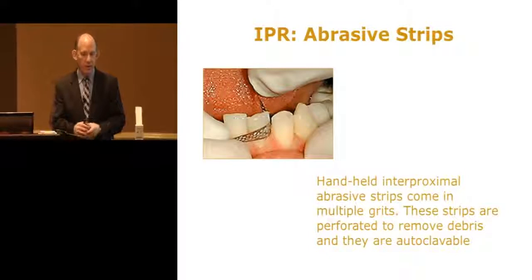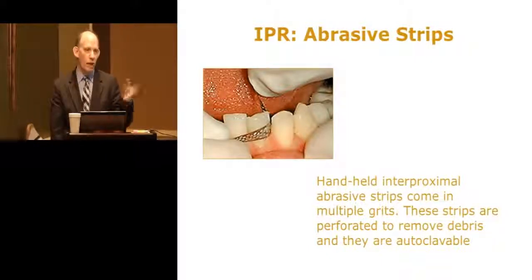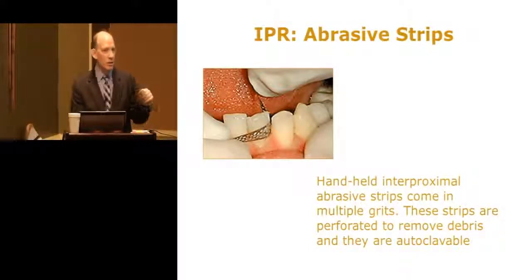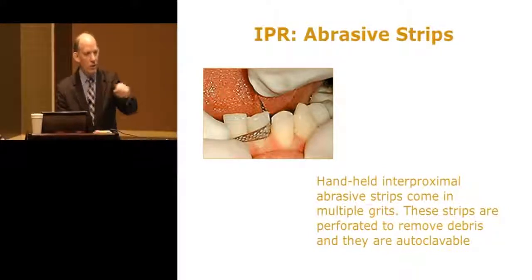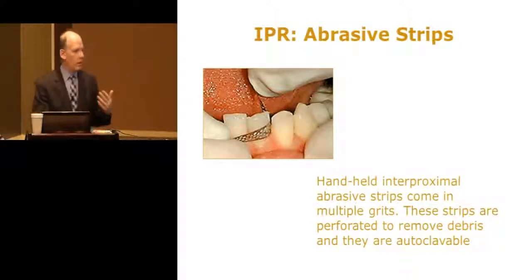So we have a tackle box, and we have the sterilized ones, and we have brand new ones, both in the same box. And I just make my decision, and I'll tell my staff up front, I call it a polka dot, so my staff knows what that means. So I'll just say new polka dot, old polka dot, and that's it. And it's just at the chair waiting for me. And then I'll just notate it in my chart, or if it's the service center, I'll check off on my physical sheet that I've done it, and I'll put my initials. That way I know what I've done.